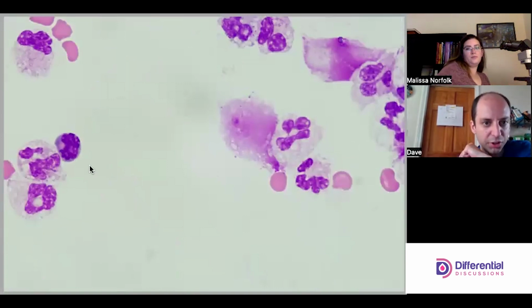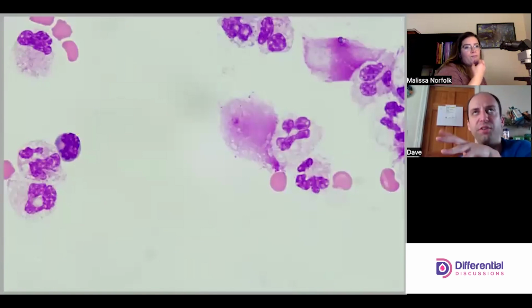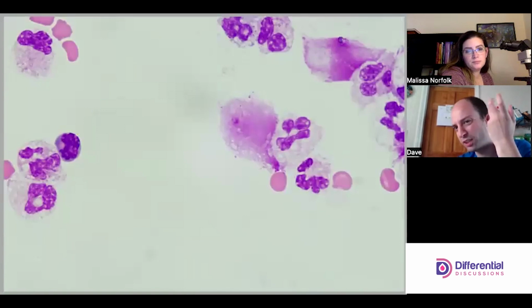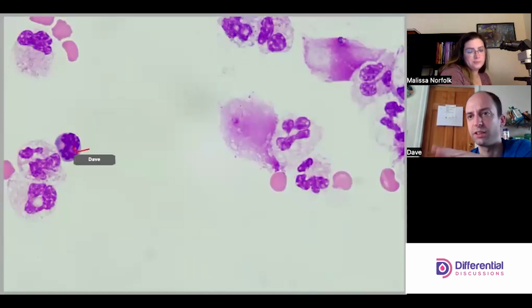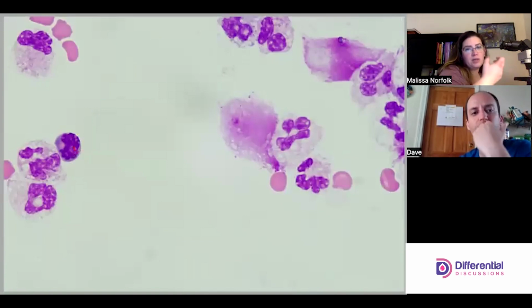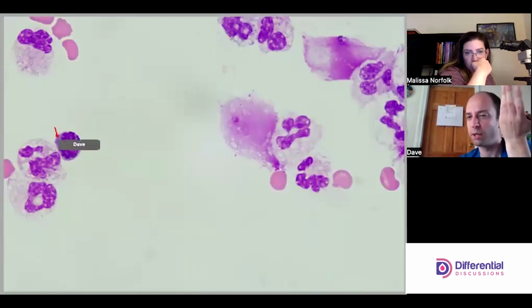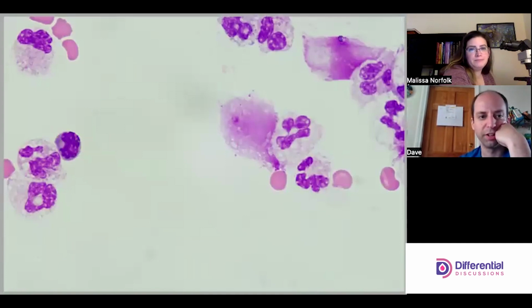So this fella's a little interesting, right? Lymphy, right? Running through the possibilities of things it could be, lymph is the only one that truly makes sense. The other thing, much less likely, would be a nucleated red cell or something like that. But I think this looks lymphoid. The chromatin pattern is just inconsistent. He just looks clumpier, so I wonder if he's becoming reactive. Yes, he might be, because the color of the cytoplasm is a little odd to me, very dark blue.